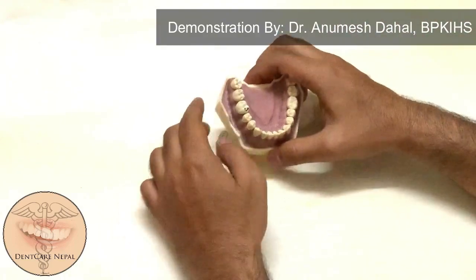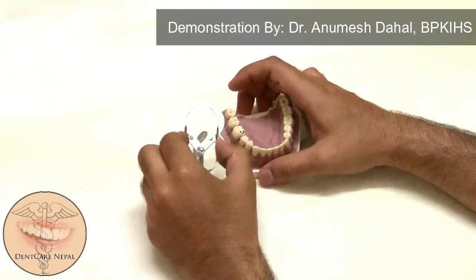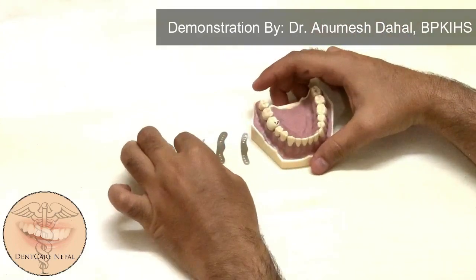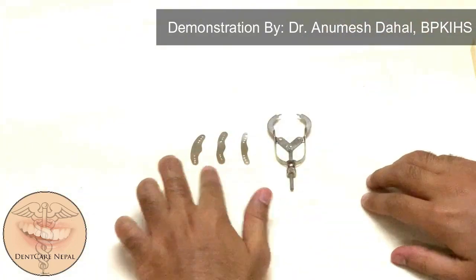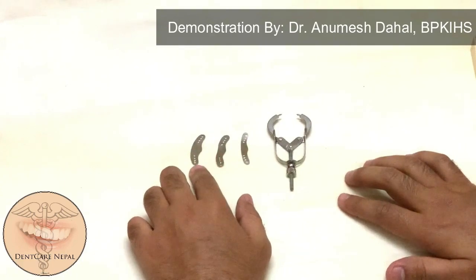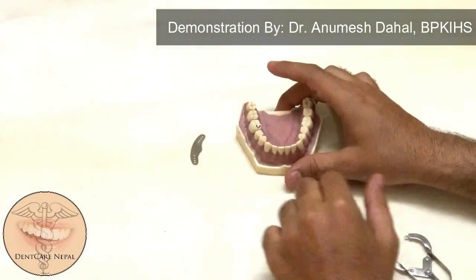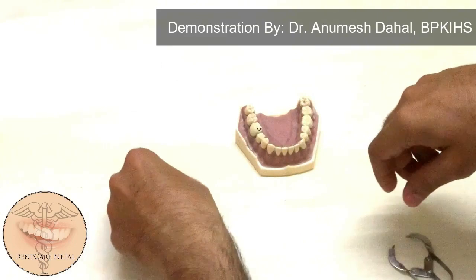Now, how will we place the matrix band? I will use the matrix band along with this retainer to restore tooth 4-6. First, there are three sizes available in the market: small, which can be used for anteriors; medium size; and the large one, which is good for use in molars. Since our tooth of interest is 4-6, we'll take the appropriate size.